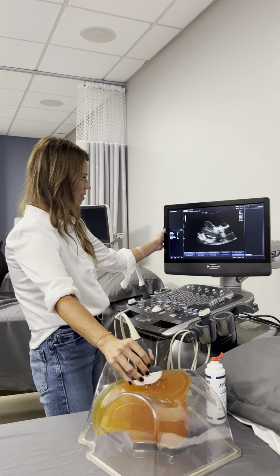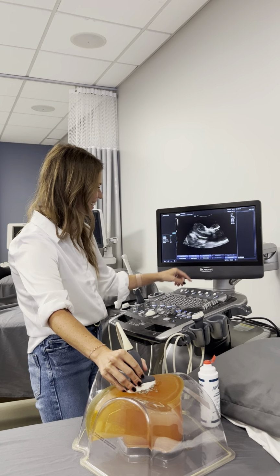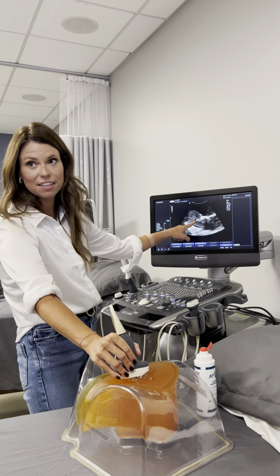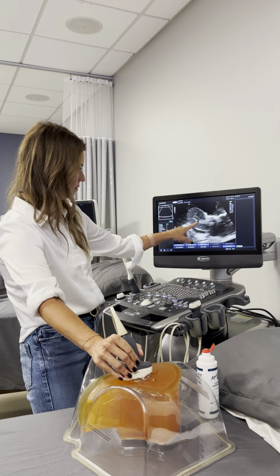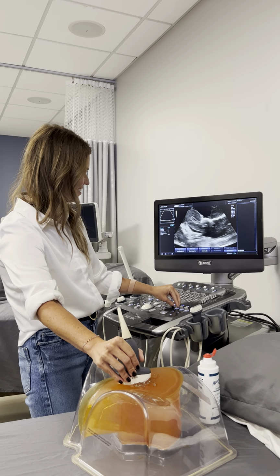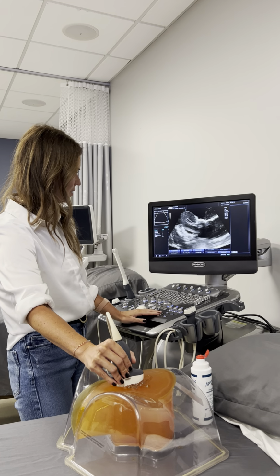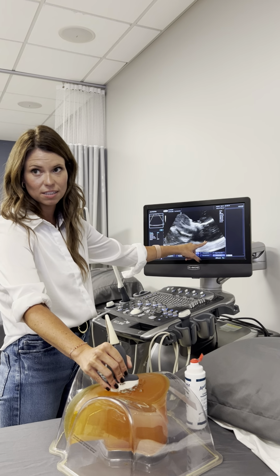We'll see. So she's broken a little bit. She has some air in her. But you can see her little endometrium, which I can see 3 lines. So it looks like she might have a proliferative phase endometrium. Do you guys see anything? Come closer. So this is the fundus of the uterus. This is supposed to be the cervix, but she broke.